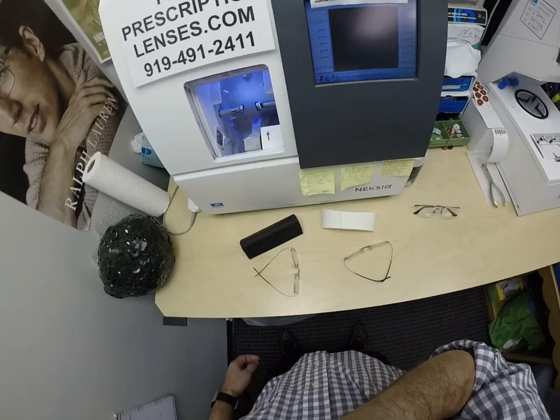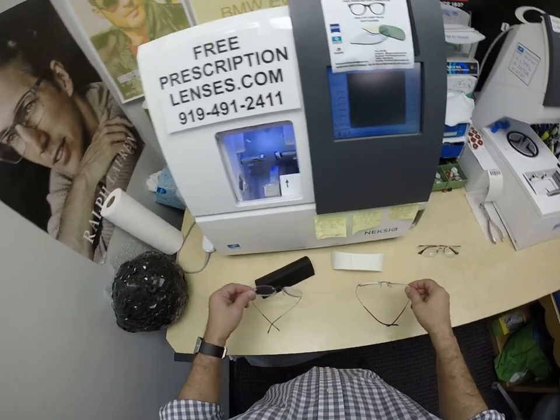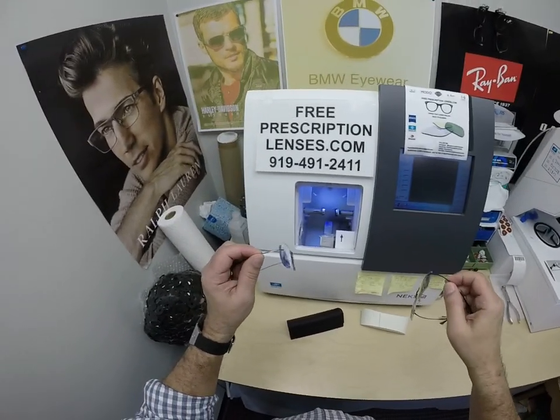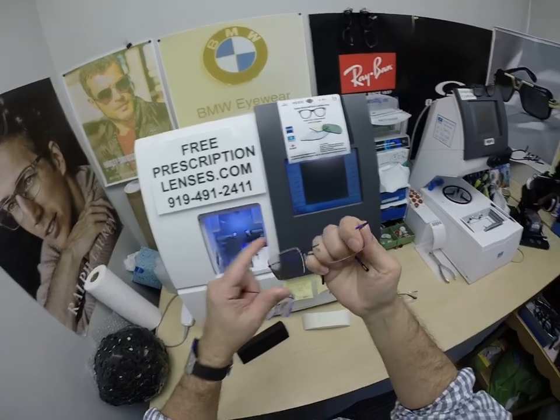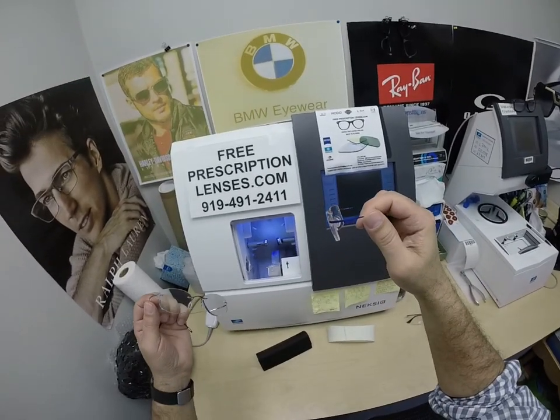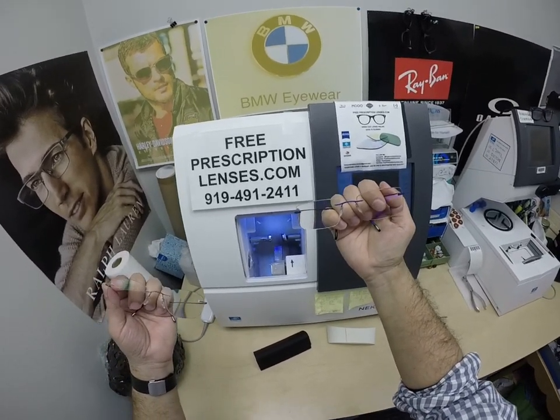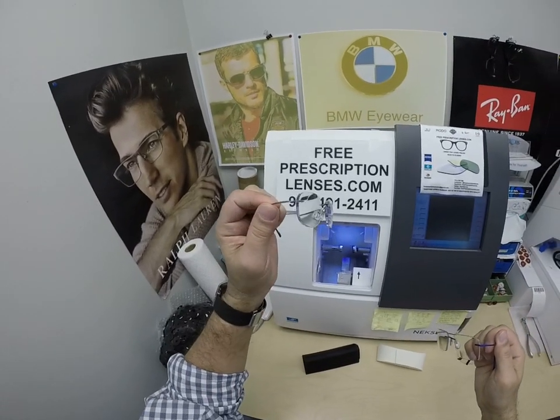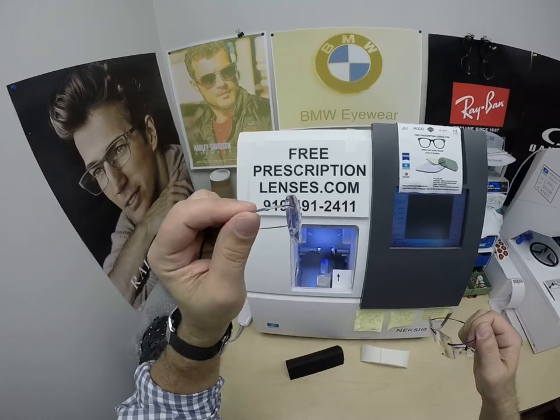I just want to take a moment today to do a little FYI comparison on the types of edge finishes and edge treatments you can get. I have a Silhouette here in my left hand — my personal Silhouette frames from a few years ago, back when I was wearing other people's brands. Jay in Slaughter, Louisiana got these and he requested a polished edge.